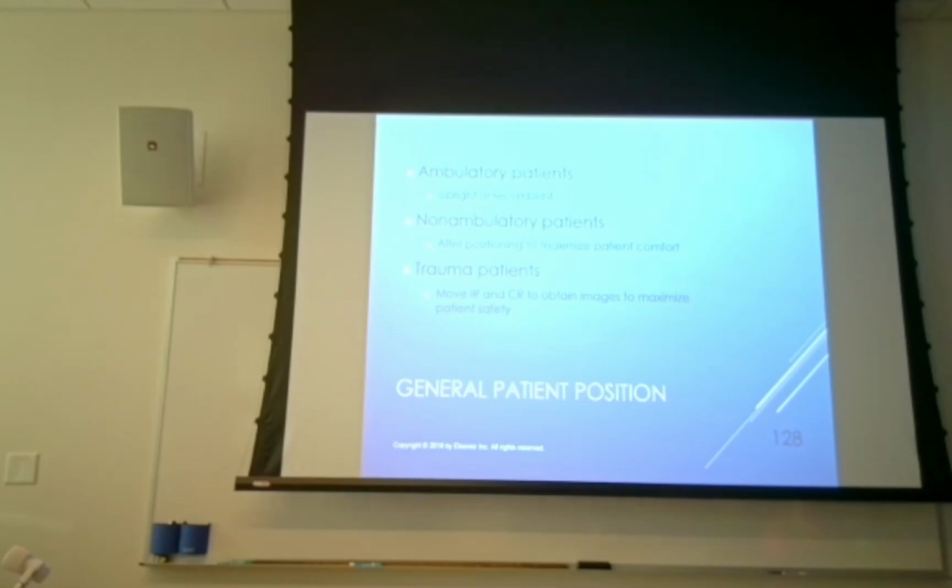But if you happen to be working in a hospital where you actually do plain film radiography on trauma patients, there's a couple of things we're going to be doing a little bit different. Like, for example, you probably won't do an AP T-spine even if they suspect a T-spine fracture, possibly in follow-up, but your initial T-spine image is actually just going to be a chest x-ray. So your first image in any trauma situation is always going to be a chest x-ray. Because it doesn't matter what else is going on with the patient. If their lungs are filling up with fluid, or they got a bilateral pneumothorax or whatever, and the patient's going to suffocate, it doesn't really matter what's going on with the rest of the patient. The patient's not going to make it off the ER table, right?